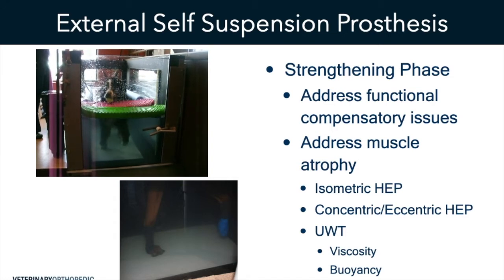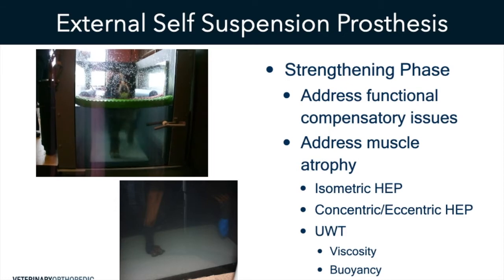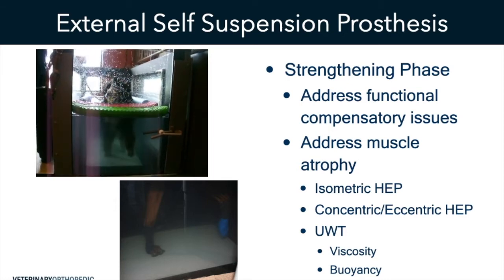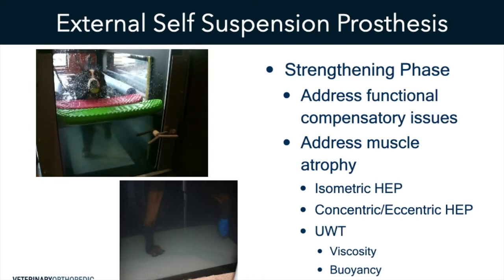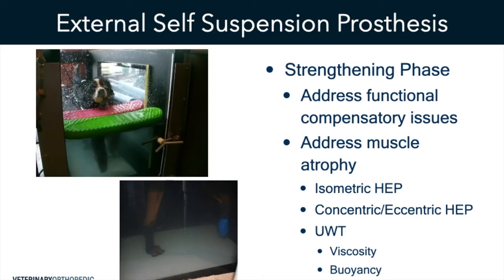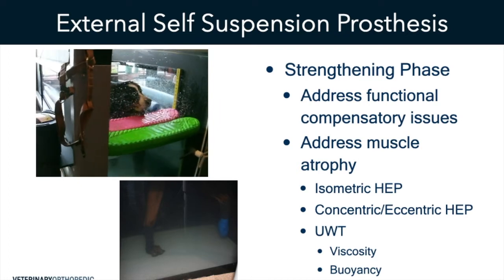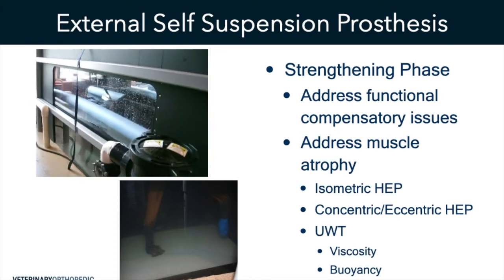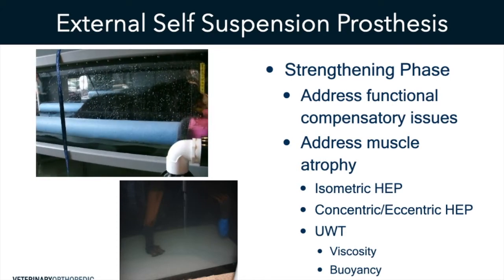This is something where we want to address functional and compensatory issues. We want to address any muscle atrophy. And there's all sorts of things we can do. And with what you're seeing here with underwater treadmill, what happens is it takes the weight off the body, okay, and therefore you have an improvement in buoyancy, so they're basically able to go around the water a little easier. You have the viscosity of it and neuro re-education.